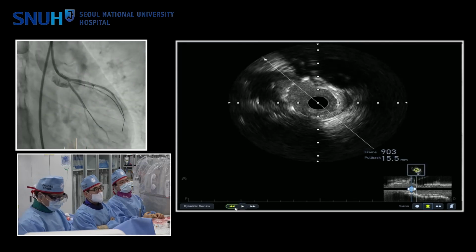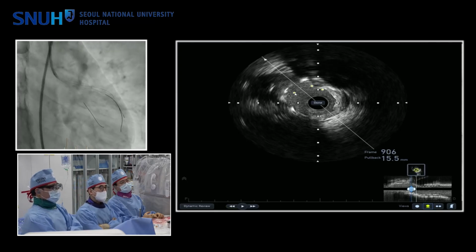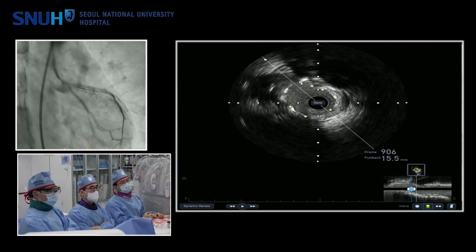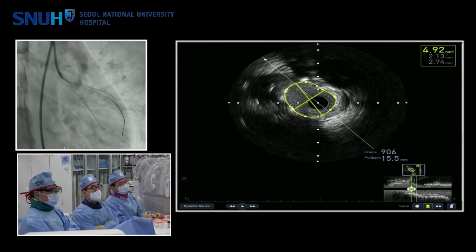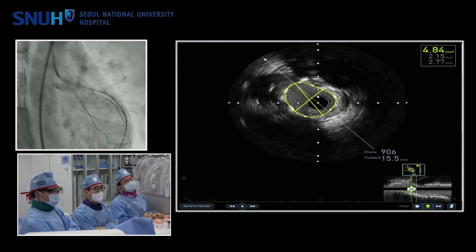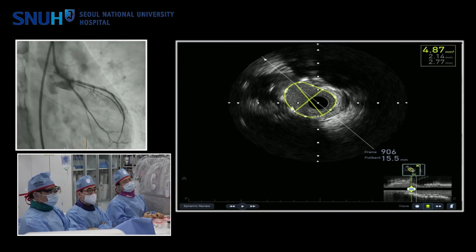We initially tried to implant a 3.0 stent, but Dr. Young's opinion was it is too big. Thus he decided to implant 2.75. But we can do post ballooning with 3.0 NC, but we have to accept carina shift further toward the RI and the circumflex.